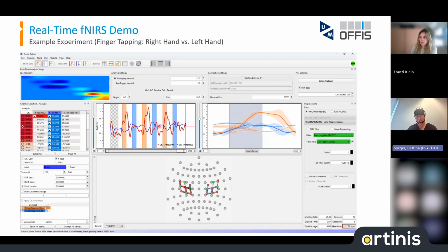And yeah, we just do 3 trials. And the statistic that you see here, which is highly also significant, you see from 3 trials is very robust, and you get already robust activity within, actually, what is it, 3 minutes? It's shown here. You can see my heartbeat was quite normal. Let's see what it is now. And here you see the event-related average. Looking into this channel, you see a nice hemodynamic response for the oxy, for the deoxy, the same for this condition. And in the other condition, in the left-hand condition, basically nothing happened. So let's see what we can achieve in our experiment.